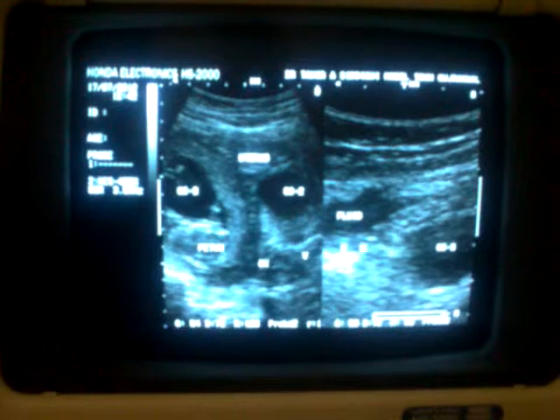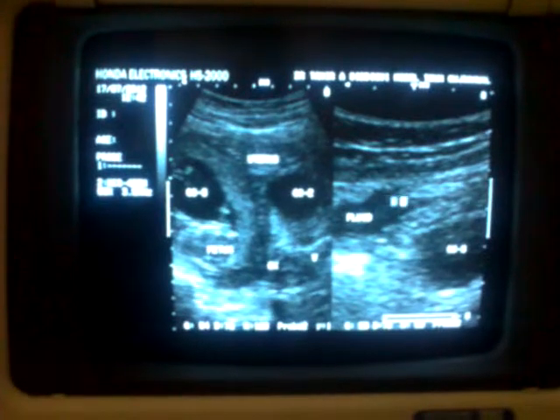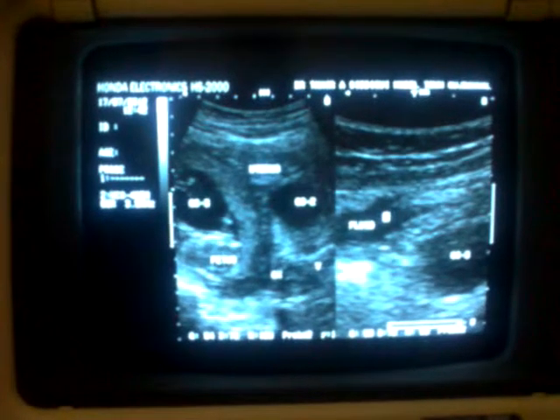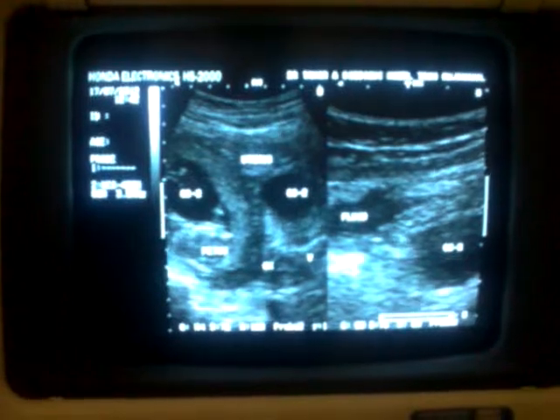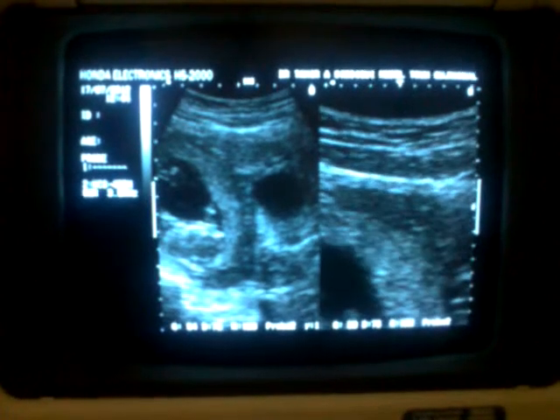Now there is a third one. This is the third gestational sac, and here you see there is fluid in the right. At the next time, I will show you it is traveling along the anterior abdominal wall. First, let us see the third sac.